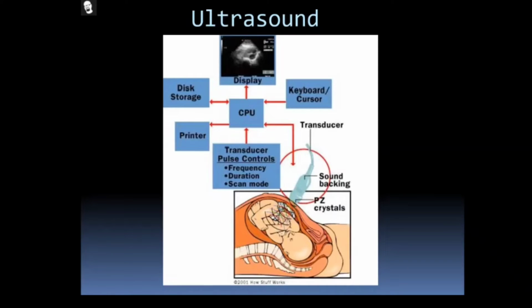Most of the companies, most of the doctors, and most of the scanners, that is radiographers, are not using that particular A mode because of less resolution; we can't see some of the internal image. So that is why they are not using A mode. B mode and M mode can be used according to the application and the purpose we need to scan.